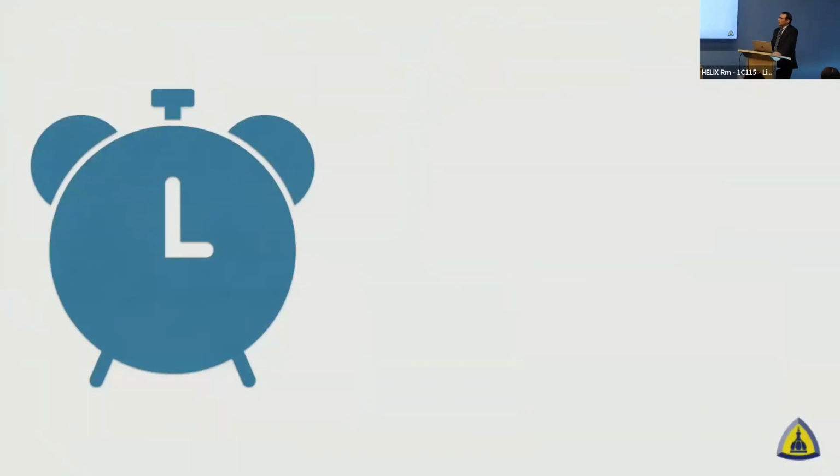So now, I mentioned patients or subjects, healthy controls sometimes for research, are just in the scanner, and we're getting these signals when they're at rest, right? But how long do you have to scan? We started off with 6 minutes because, way back in the day, there was some literature showing that 6 minutes was sufficient and reproducible to get good resting state quality data.